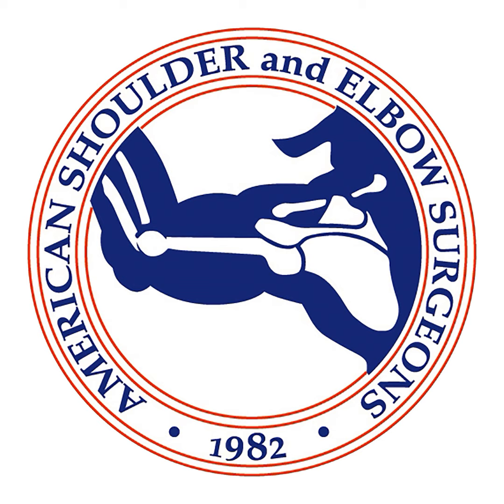So unless you have a day in the OR where you've got a bunch of young males where the chance of that happening is about 0, but if you have the average degenerative shoulder practice where you've got some older folks, especially older females, I think you really need to have a stem implant available, or else you could get yourself into a situation where you're not going to have stable fixation. Again, that's exceedingly rare, but it does happen.